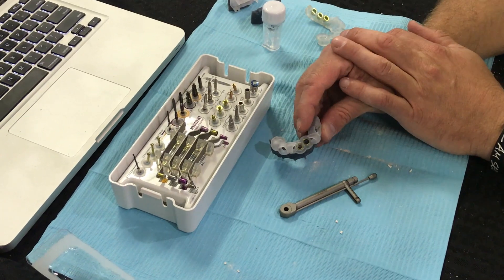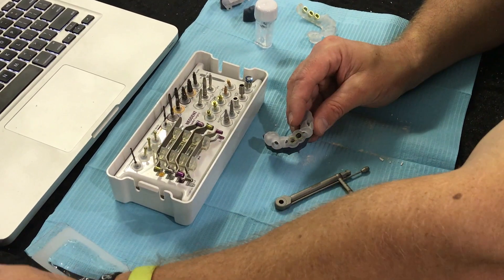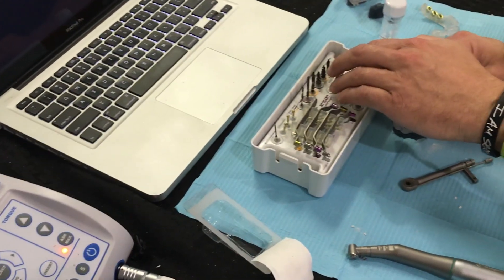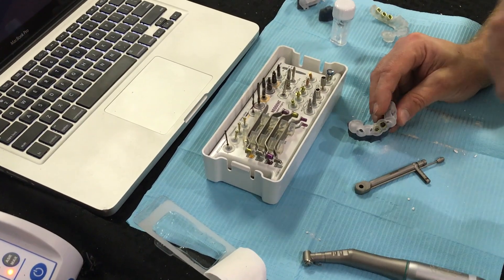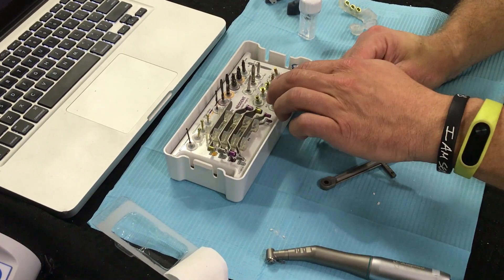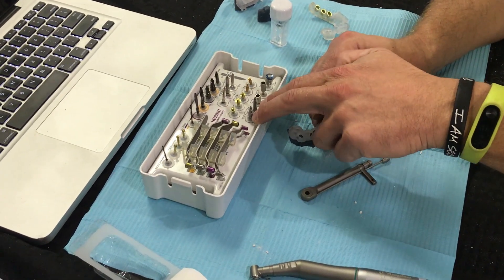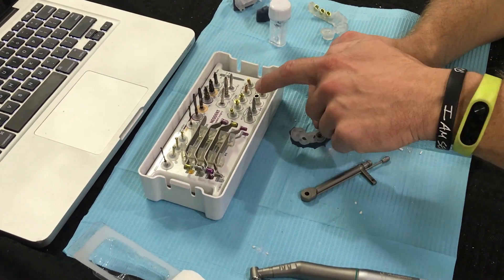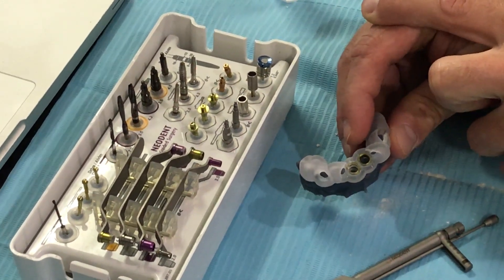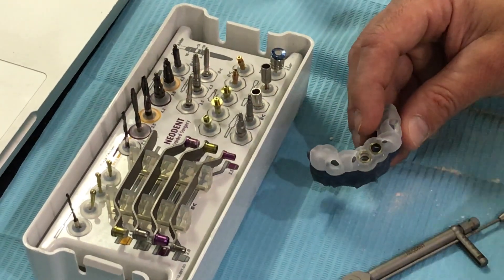The second row has our bone taps. If need be, if the bone is dense, we would slow down the speed on our motor to the same speed as the implant and we would use this bone tap to create a little bit more threading in the osteotomy. Along the bottom we have our implant drivers, two different slight diameters on the sides to fit the sleeve, then an adapter to fit the top to allow us to manually place this with the torque wrench, and lastly our screwdriver.